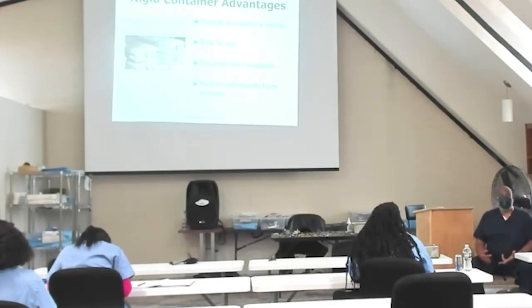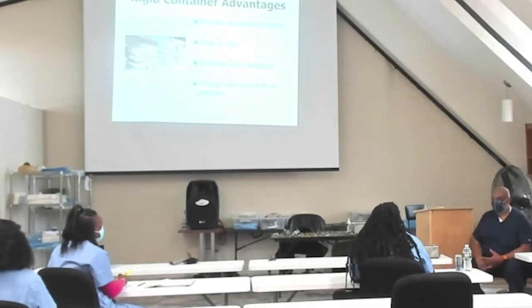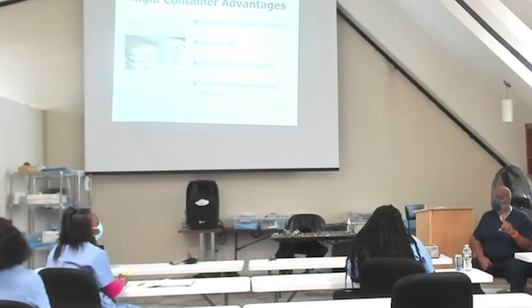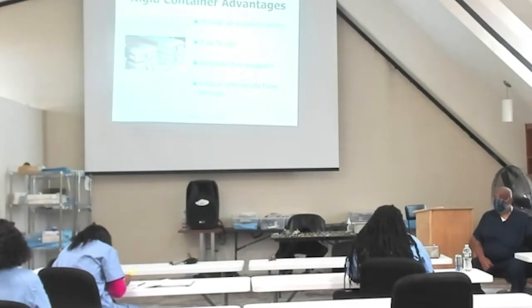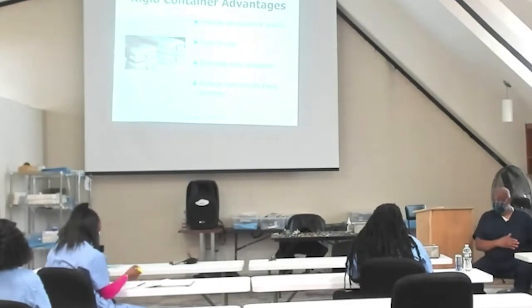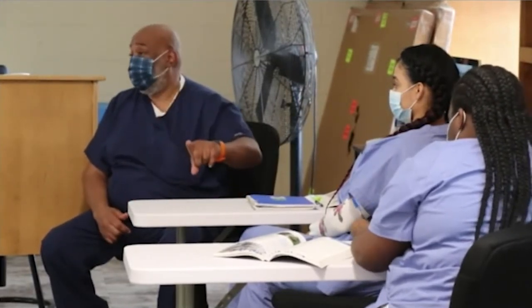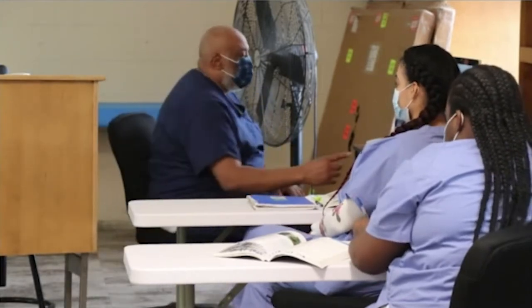When they come, we know that we clean them, true? And how do we wrap them? With wrap. But they only come just for that one case, and after that case is over, they go back. And this is what Shalaya said, we send them back clean. They come in, we clean them, and after the OR uses them, we clean them, we just don't rewrap them. And for those that they don't use, because remember, loaners could be 2 to 20, whichever ones they don't use, we can just unwrap and send them back. They won't have to be cleaned again because they were never used. Just FYI.